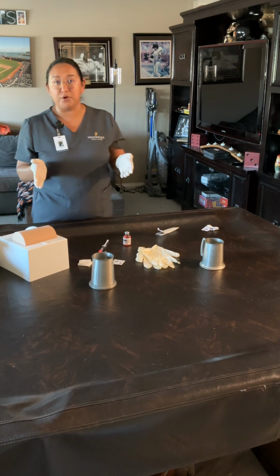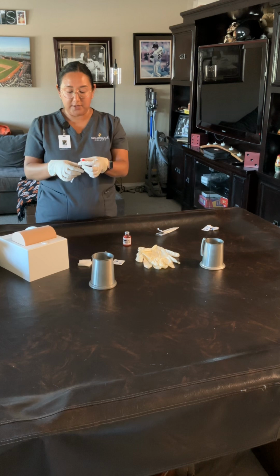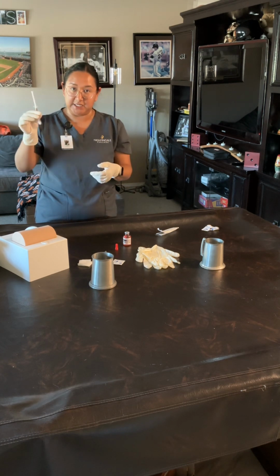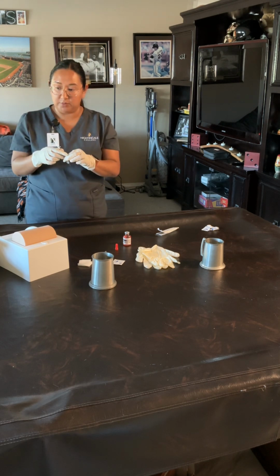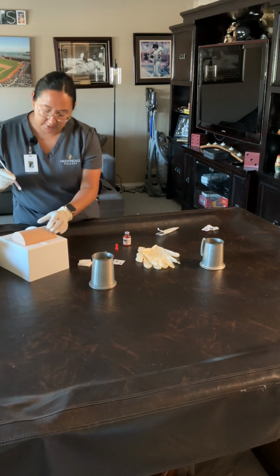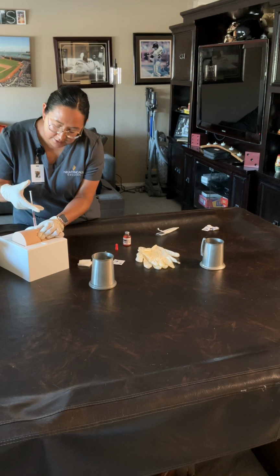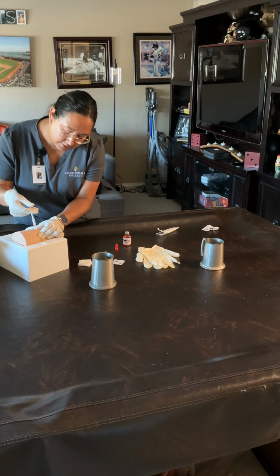So because it's a heparin injection, I will need to pinch it. So I'll get this going. Open that. So I'll pinch and measure the needle and make sure I stick it at either a 45-degree angle or a 90-degree angle. So I'll pinch the skin once it's all dry. It looks all dry here. Here we go. So let me pinch the skin. Poked it here. There it goes. Great.